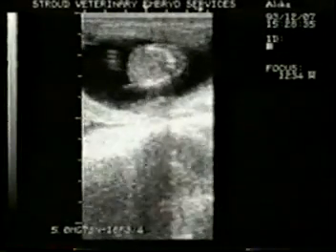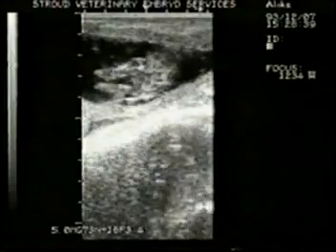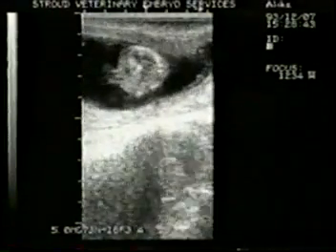Note the male genital tubercle as the transducer passes back and forth through the abdomen, near where the umbilicus attaches to it. Notice the beating heart in the thorax.